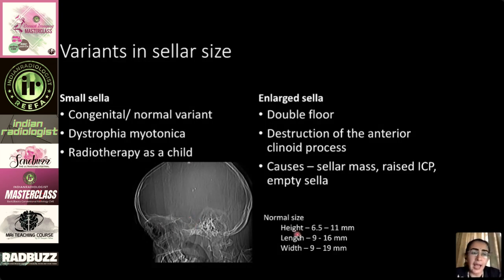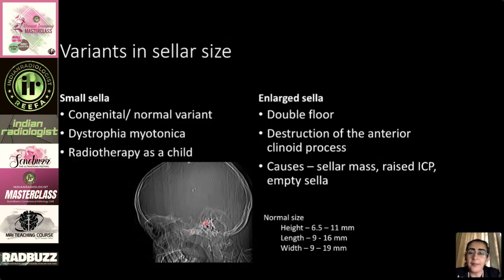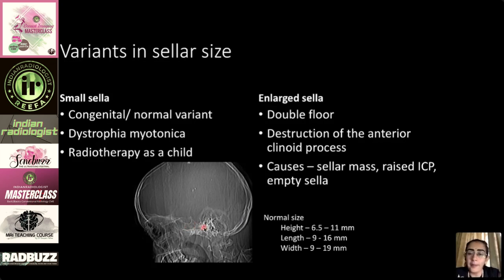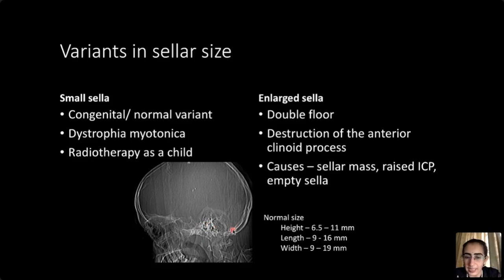Note the normal size of the sella for future reference. A small sella can be a congenital variant or can be seen in dystrophia myotonica or following prior radiotherapy. An enlarged sella can be a normal variant such as a double sellar floor, or can result from destruction of the anterior clinoid process, erosion, sellar masses, or raised intracranial pressure — including idiopathic intracranial hypertension.